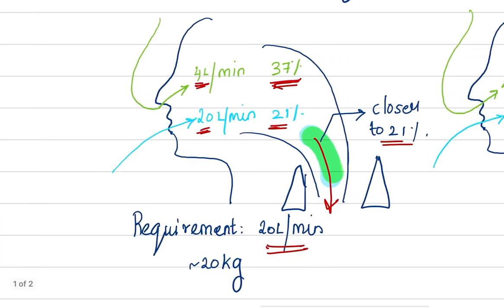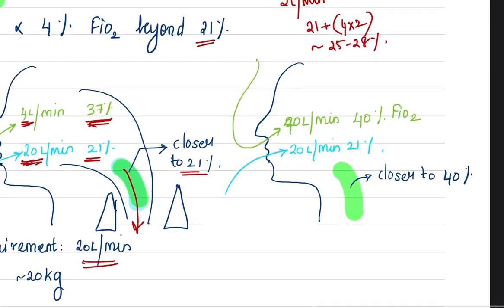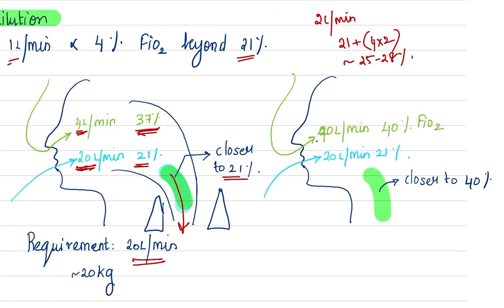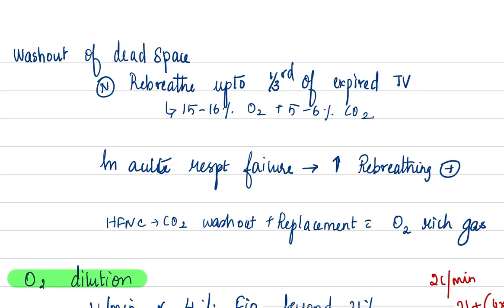All right. So if you are going to meet this demand and more for the patient by giving through a nasal cannula, say you are giving 40 liters. This is a 20 kg patient. 2 liters per kg per minute is what we generally start on HFNC. Then you are giving 40 liters per minute, and you can set your FiO2 at 40% in your HFNC machine. And the patient, suppose, is trying to take in 20 liters. So even if the patient is trying to take in 20 liters, what goes in is something closer to 40% rather than something closer to 21%. So you have met the inspiratory demand, you have met the oxygen requirement. So both of them will decrease your work of breathing for the patient. Okay, so that is how your HFNC helps.